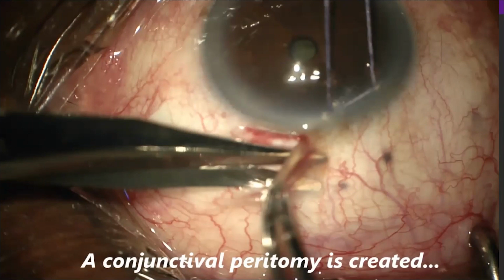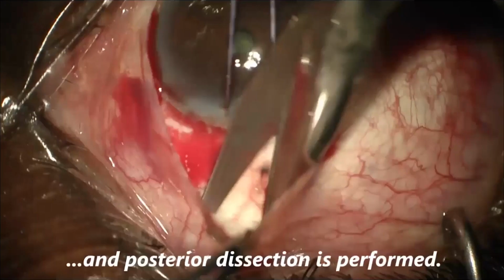I often make a relaxing incision because it's kind of hard to close with 2 wing sutures when you are trying to pull that pocket back further. It's because you have to start that tunnel entry 3 millimeters posterior to the limbus. I like a good pocket, so I do some dissection posteriorly. iGOMED is a big proponent of this. You want to be careful over the superior rectus because you can induce a good amount of bleeding. So you may want to stay a little more nasal or temporal when you're starting to make this pocket.